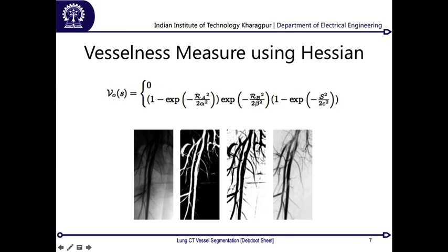But using this kind of a filter, you would be able to very easily get a vessel map against a black background, which is just the opposite of this particular vessel map which I am seeing over there. Now using these two factors, you can obviously correct for the intensity inhomogeneity over here, and then you can get this sort of an image. So essentially it would subtract out everything in the background other than the vessels, kept in their raw intensity, and now what I get is an angiogram image or a map of all the vessels in its original form without the inhomogeneity in the background intensity at all.